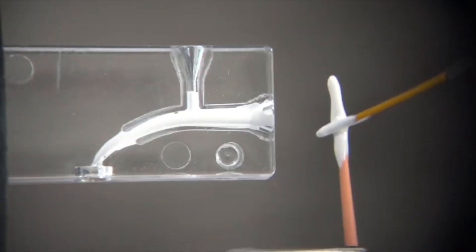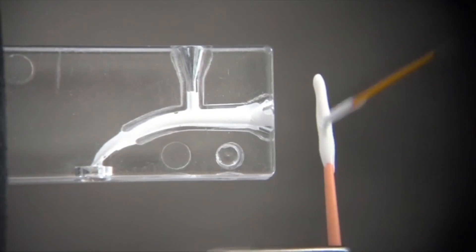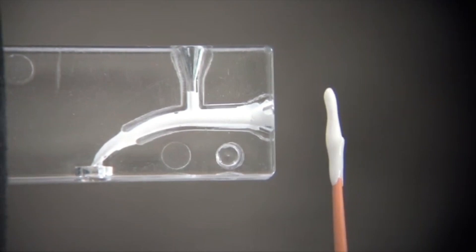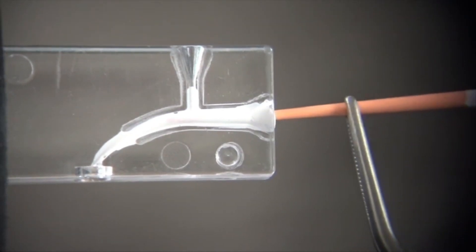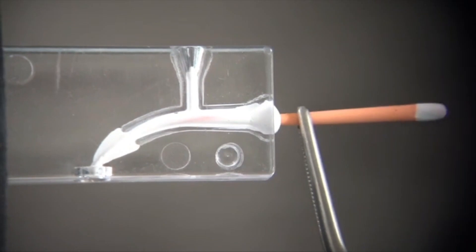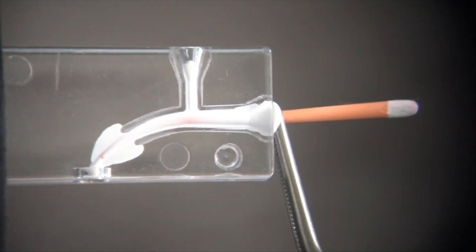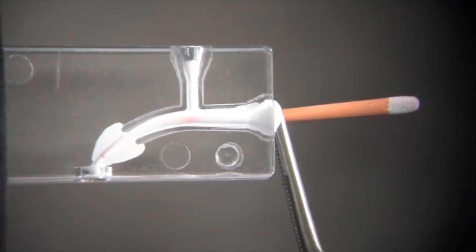After pushing the sealer, take the cone and butter it up at the tip, and then slowly insert the cone through the sealer, making sure that it reaches the full working length. Confirm seating and make sure that the reference point is reached.